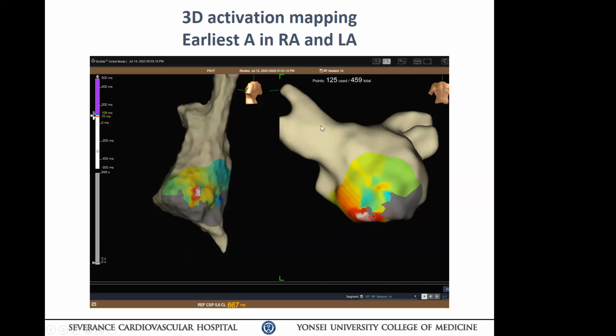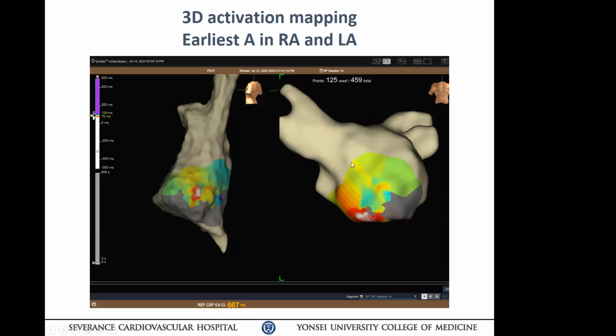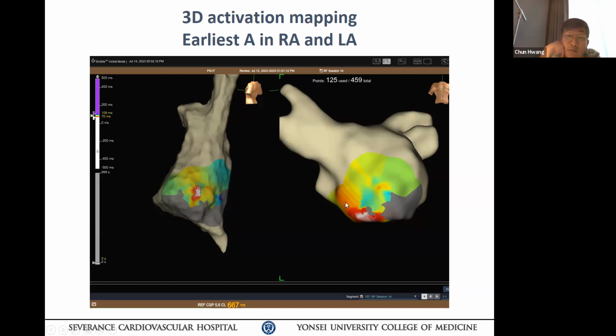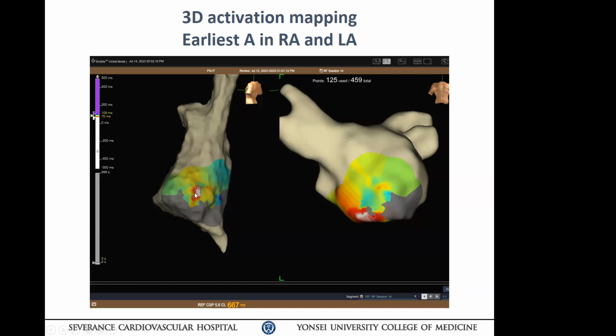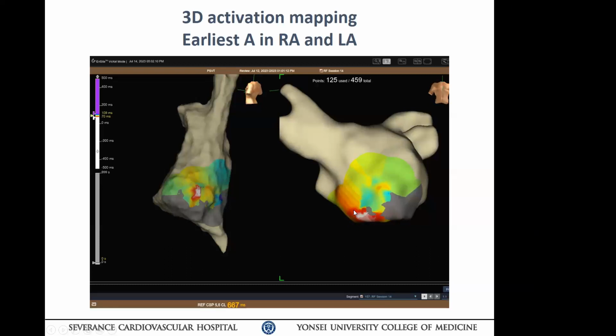아니, 거기가 septum입니다. 지금 짚고 있는 게 septum입니다. LA를 어디가 septum이야? LA지 이 사람아. 이게 lateral ridge, 어디가 septum이야 그게? 이게 LA. 이거는 septum이고 LA 뷰 봐. LA left pulmonary vein, common trunk 밑으로 타고 들어가잖아. Wavefront는 아래입니다. 요건 RA, 아래고, left side map, right side map이 LA 아니야 그거? 이게 LA입니다. 그렇지.